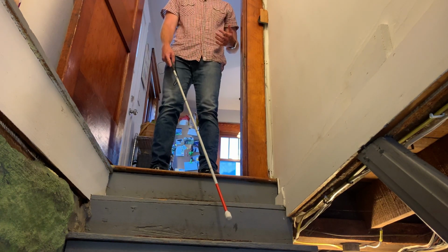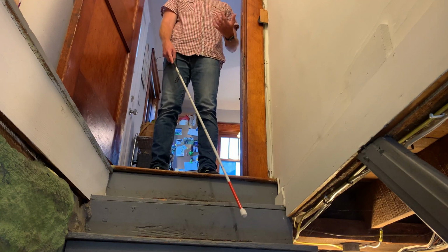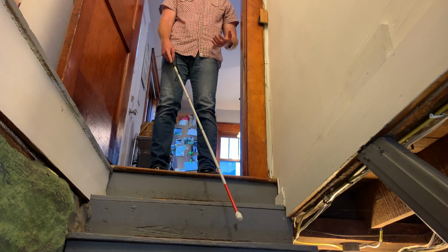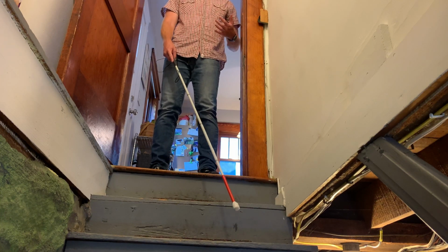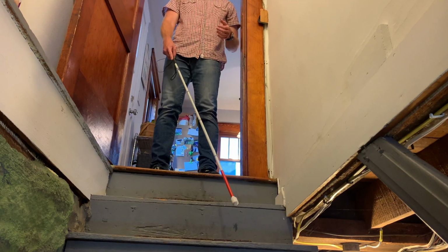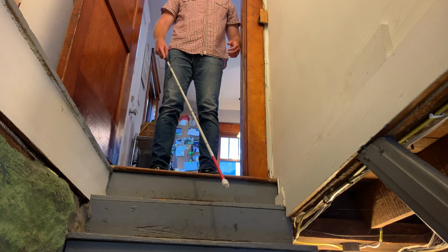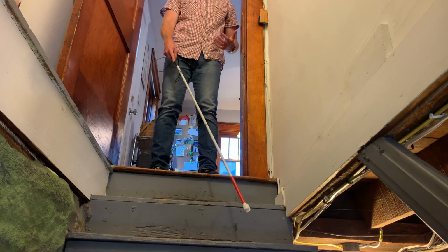So now for step number 5, after you have the cane in index finger grip and in diagonal cane technique, you want to point the cane down the stairs. So right now, the cane is out in front of me. My cane tip is at 11 o'clock, 12 o'clock is straight in front. My right hand is holding the grip to the right of my right hip, kind of by my right pocket.